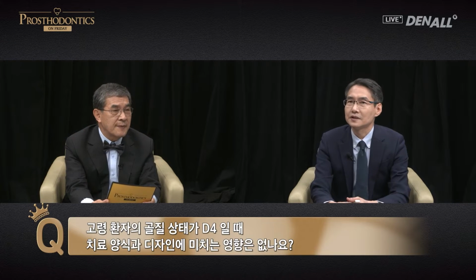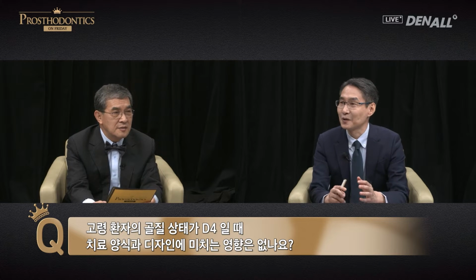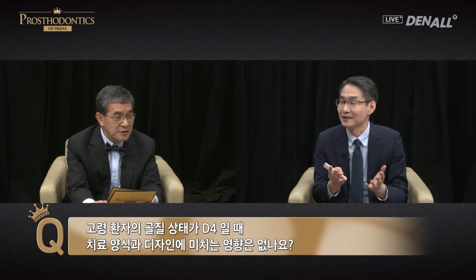When we treat elderly or older female patients, at times the bone quality is very bad. We can see patients with extremely spongious bone. It's almost like an empty eggshell. And implant placement can be difficult in those times. At times, it can be difficult to overcome the obstacle, but in most cases, there are multiple options.